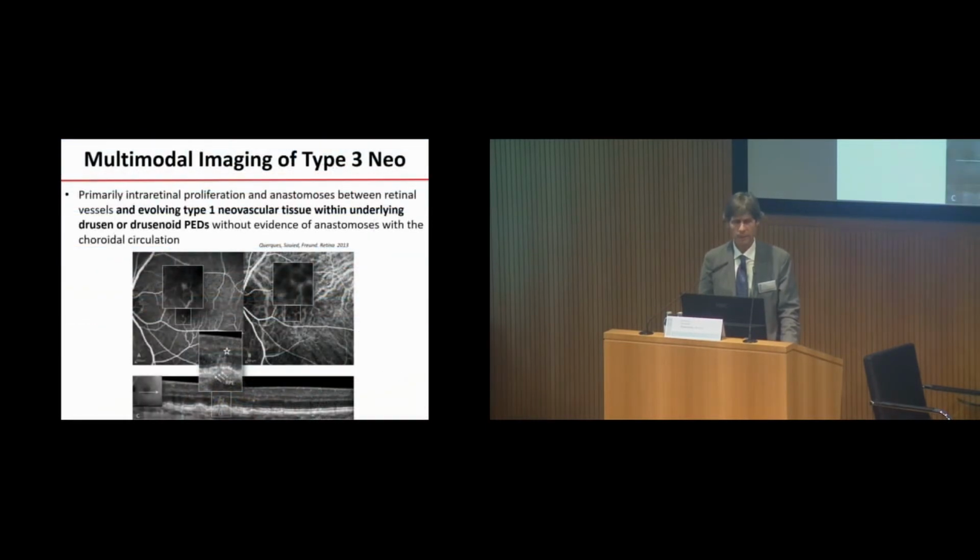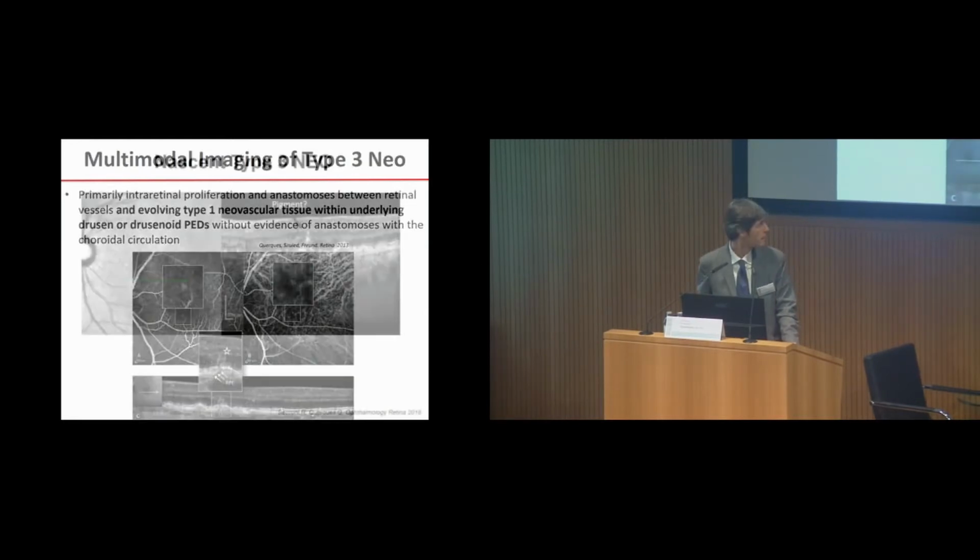And in this publication, at the time we just had structural OCT without OCT-A, we were able to demonstrate the very early phases of the disease that were localized at the level of the deep capillary plexus and with a strict relationship with the RPE from the beginning, even in absence of exudation, as you can see from this slide, no exudation on structural OCT.